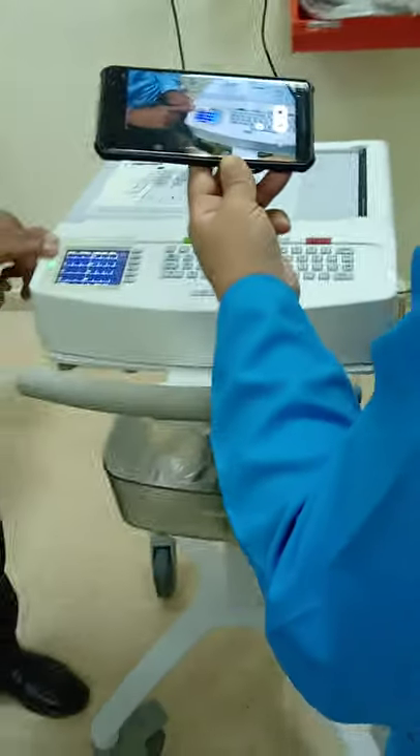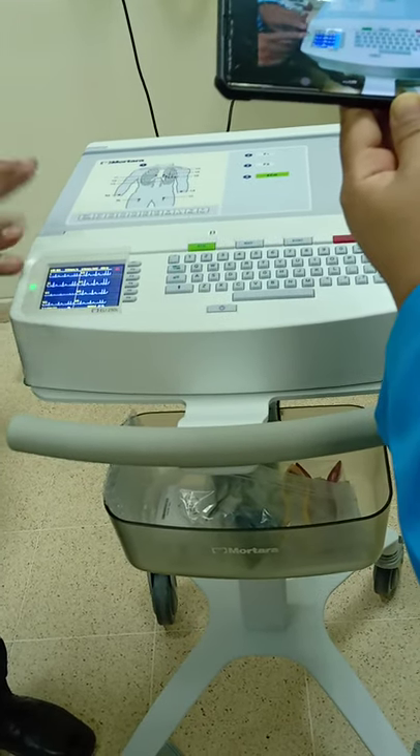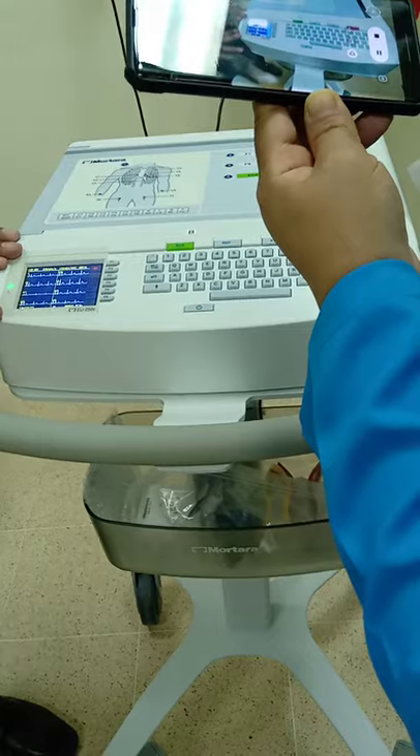So if it is green, that means it is clear, and you can view and preview the ECG here to make sure that the connection is perfect.